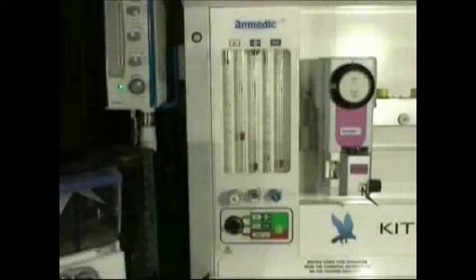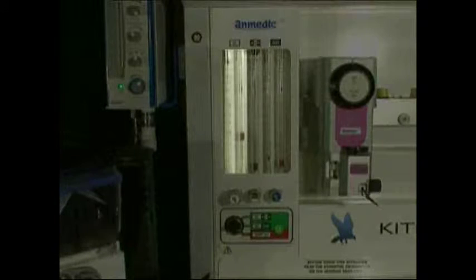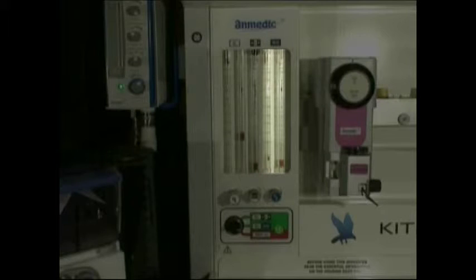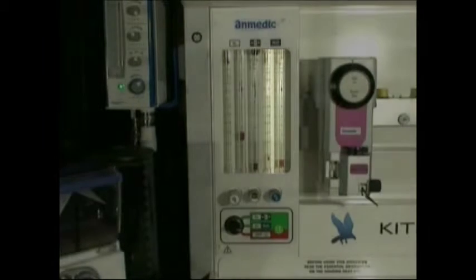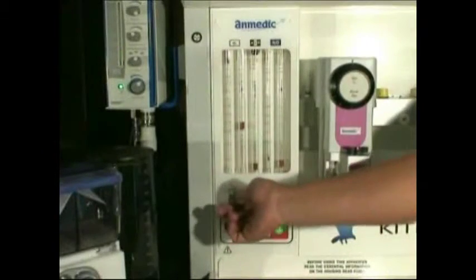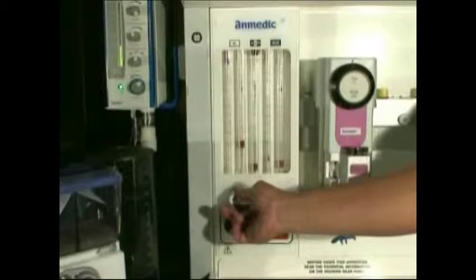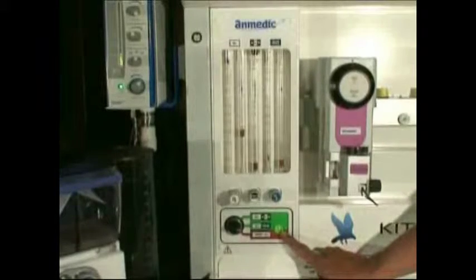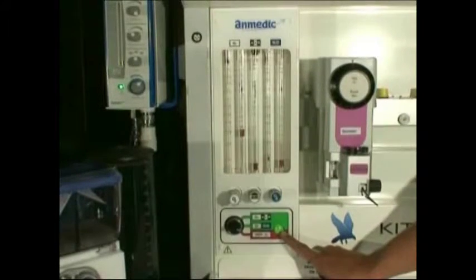Volume control console. The present picture shows the volume control console consisting of a pair of rotometers for oxygen, one single rotometer for compressed air, and a third rotometer for the nitrous oxide supply, comprised also of 2 glass tubes. The gas flow is controlled by turning clockwise or counterclockwise the corresponding metering valves. Beneath the volume controls, we see the cylinder selector, including one alarm marker monitoring the cylinder content.